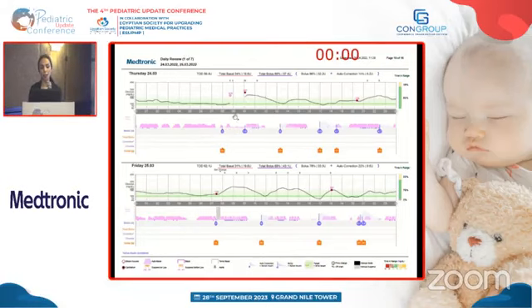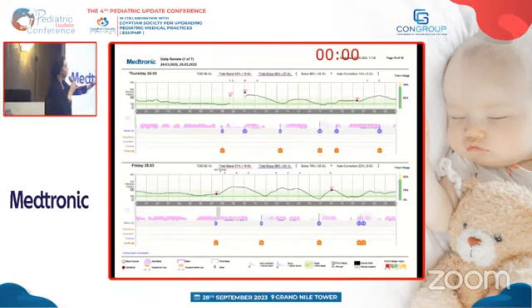بعدها حصل هايبرجليسيميا، لو احنا هنا بدأنا كانت الريدنج 100 تقريبا، بعدها زدنا ل 250. هنلاقي في تاني يوم في نفس الوقت برضو حصل ارتفاع، ان انا هنا الفطار كان الساعة تقريبا 7:30 دخلنا الكارب، بعد كده حصل انكريز ديورنج الفترة بتاعت الميل.